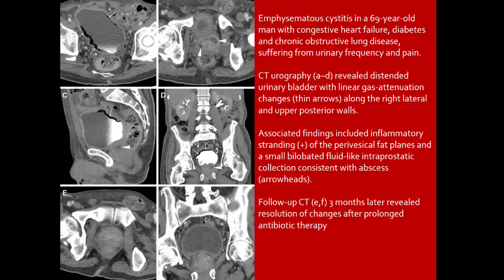Emphysematous cystitis in a patient with congestive heart failure, diabetes, and obstructive lung disease. CT demonstrates urinary bladder with linear gas attenuation along the right lateral and upper posterior walls. Associated findings include inflammatory stranding, perivesical fat planes, and small bilobulated fluid-like intraprostatic collections. Resolution of these changes after therapy is demonstrated.